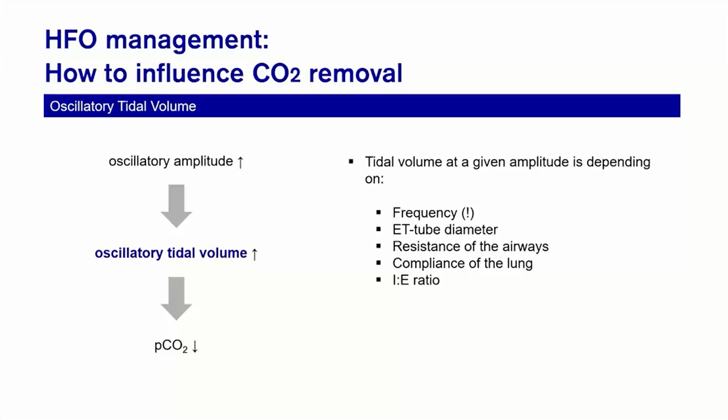So keep this in mind, because if you have, for example, mucus accumulation, you will see that the tidal volume can drop very quickly.